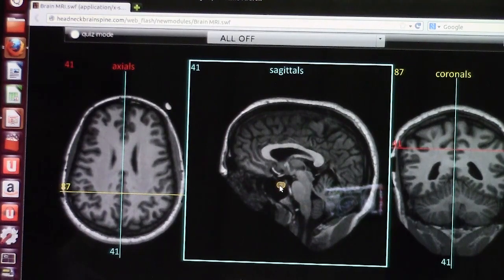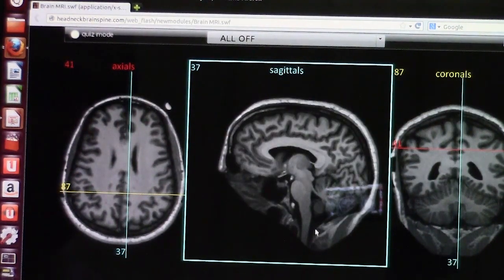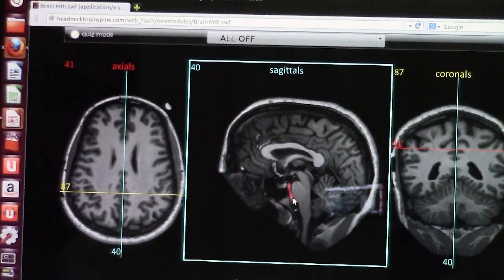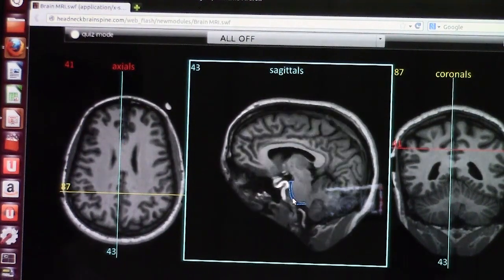When reading MRI, you are responsible for looking at all parts, including the calvarium or bone, checking for any abnormality. You can also see the vertebral artery and, going up, the basilar artery. It is important to look at these structures because sometimes you will see dilatation of the basilar artery or a thrombus within it.